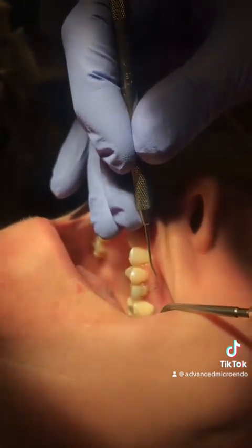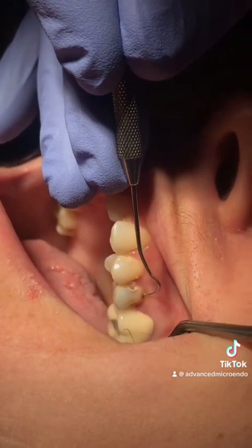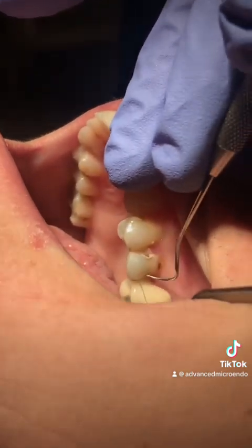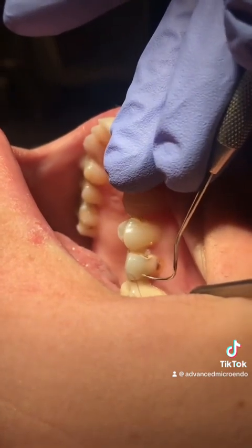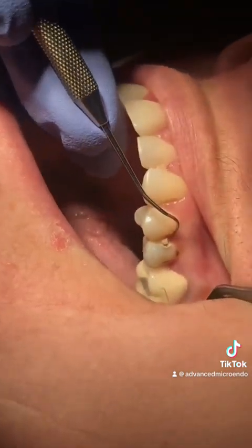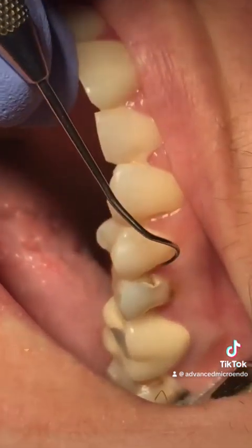All right, so this is decay right here. That's decay. All right, down here is decay. Right there, that's decay, and up here, if you come up here, that's just composite, whatever that is.